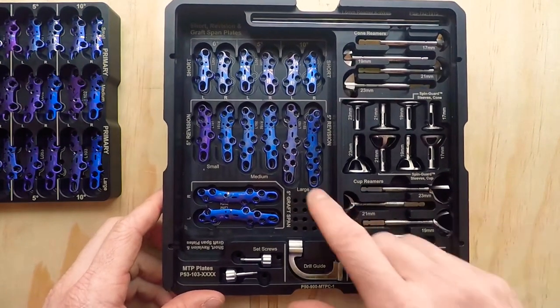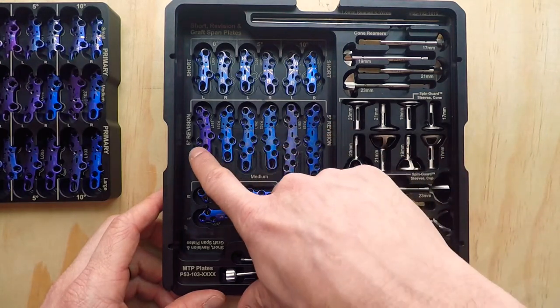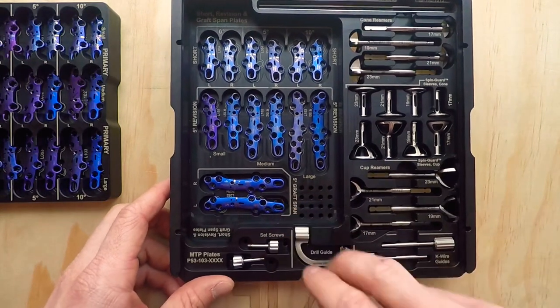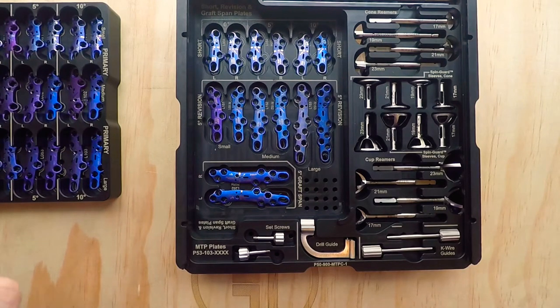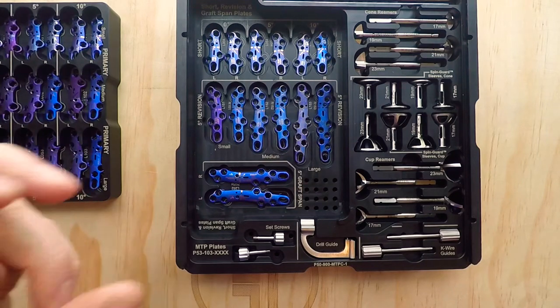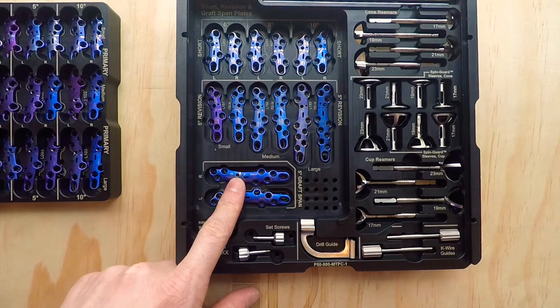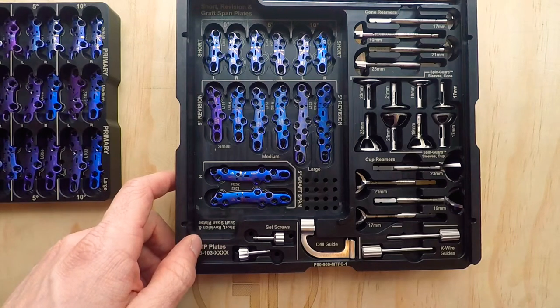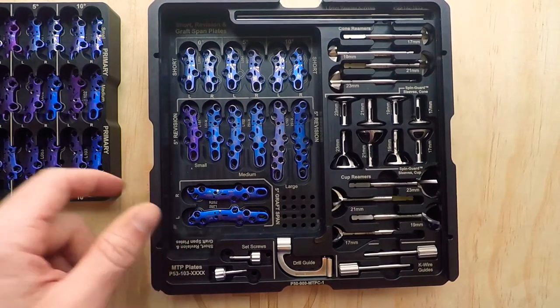Down below, these are our revisional plates. We have small, medium, and large options, right and left, with five degrees of dorsiflexion built in. Below those, we have our graft spanning plates. In a different video, I'll show our trial options and a demonstration of our MTP disc so you can understand why we created the graft spanning plates. These are designed to span a graft for a complex primary or a situation where you need to add length for the procedure.